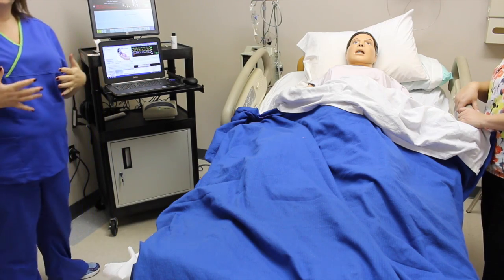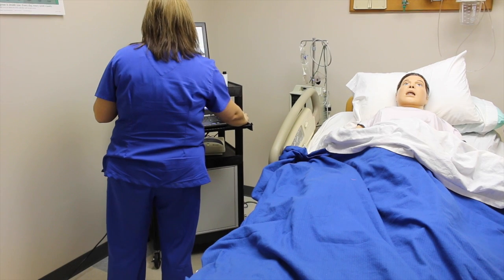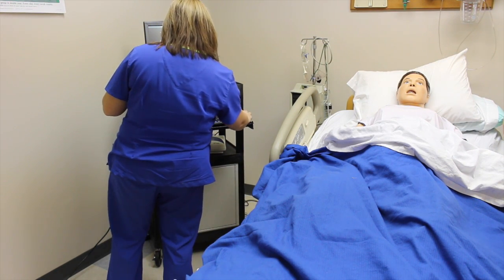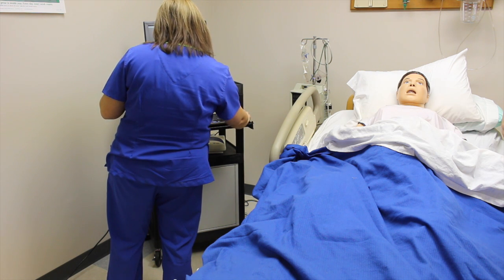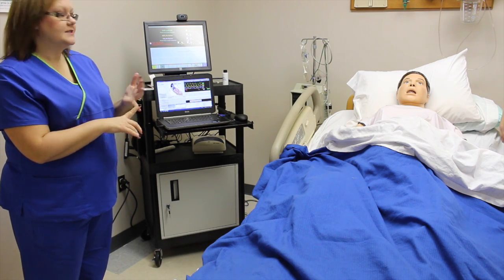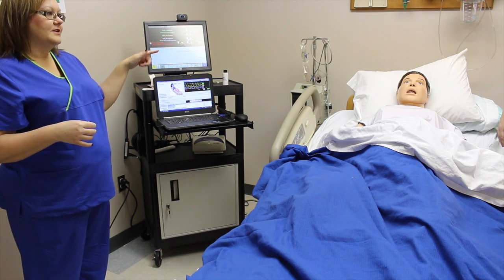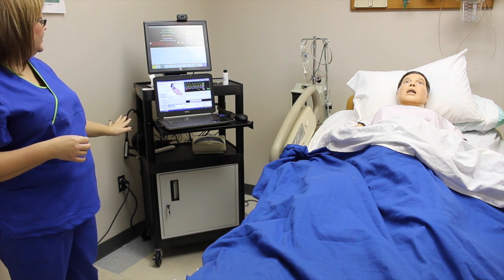Alright, so I'm going to show you some different fetal heart rate patterns, just to give you an idea of what they look like. It'll take a few minutes to actually come on the screen, but what you're going to see is an early deceleration, and you'll notice you can actually hear the heart rate changing on the fetal monitor while you're here.